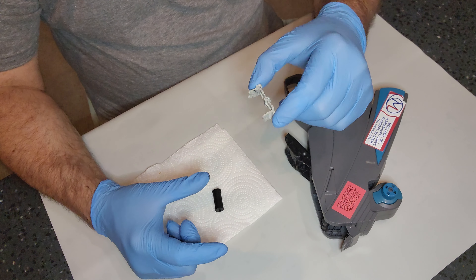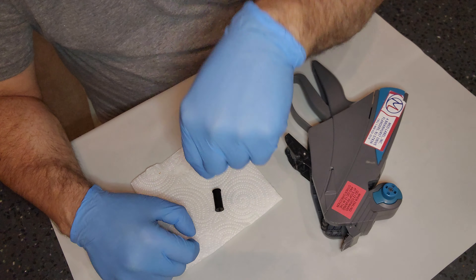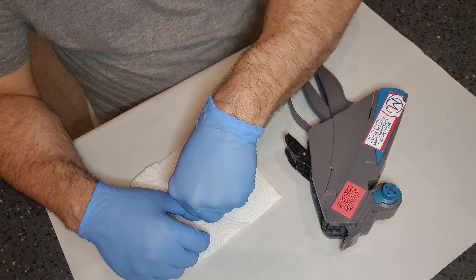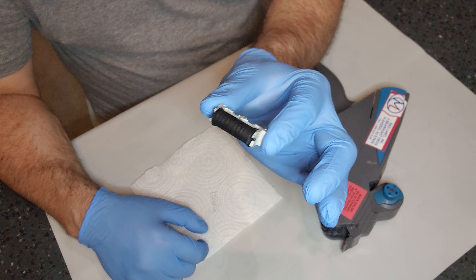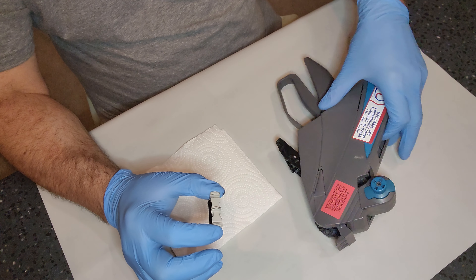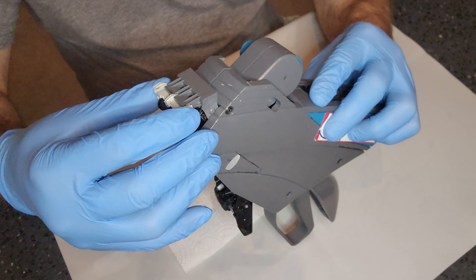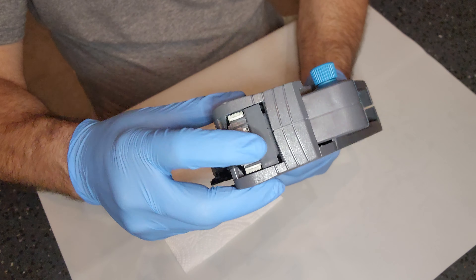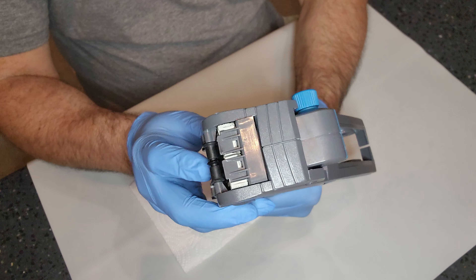The new ink roll comes in a little cassette. You see those little teeth on there — very simple. Just take the housing and put it right over the brand new ink roll and push down on it until it locks in place. You'll hear that little click — that locks your ink roll right back in. Then transfer it to your hand and slide it right back into the groove.